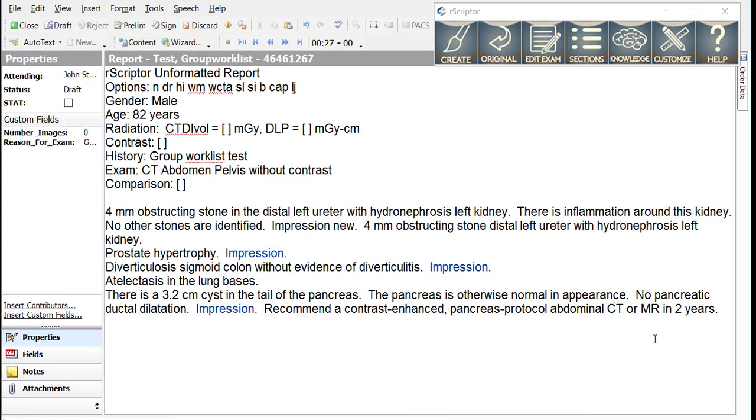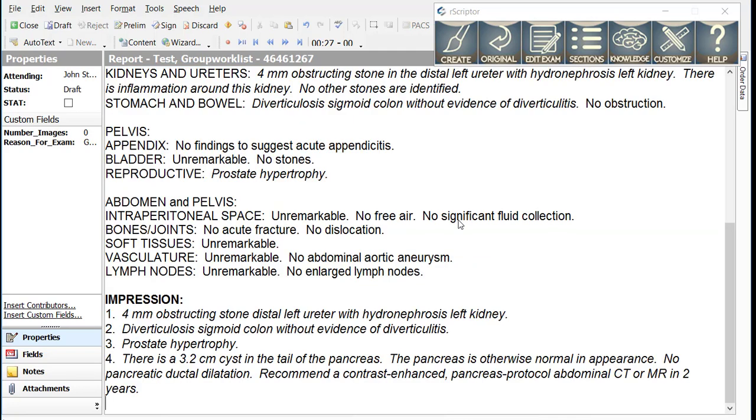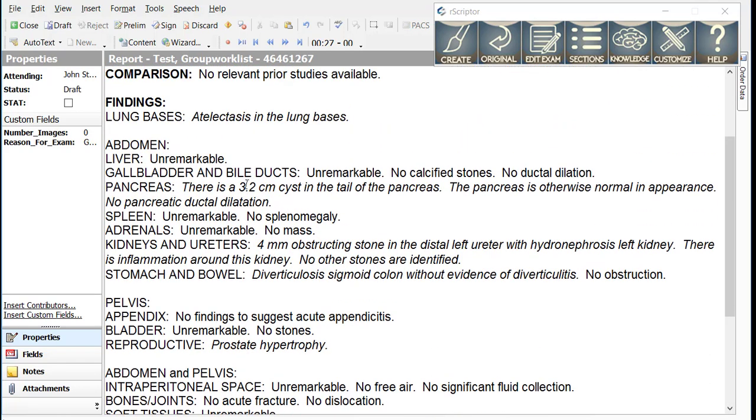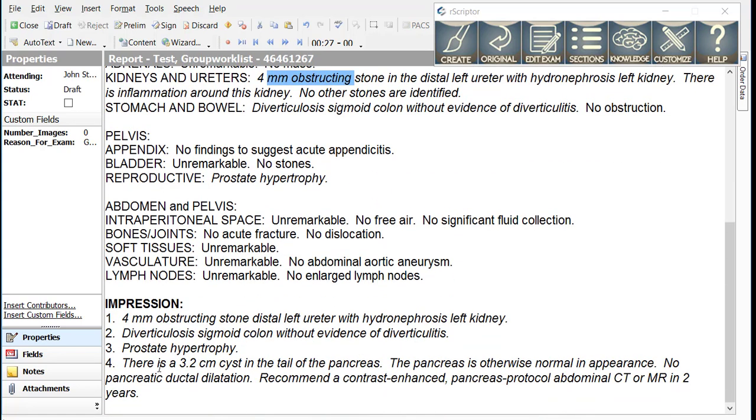With that in place, we simply push the Create Report button. And you can see both the finding section and the impression section are written simultaneously. This saves a great deal of time in avoiding dictating duplicate text in the findings and impression sections.